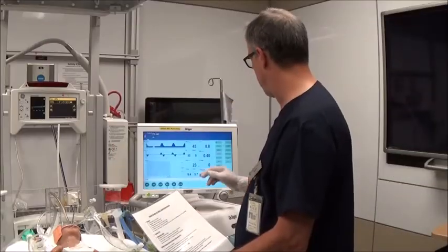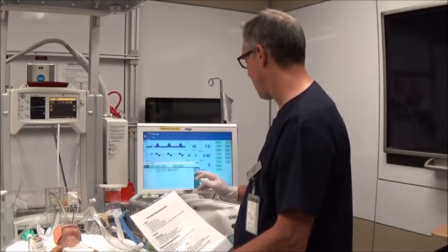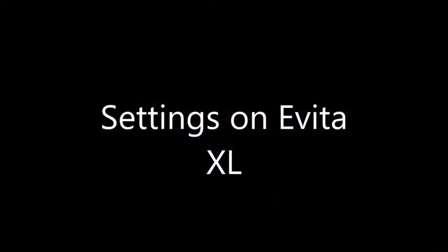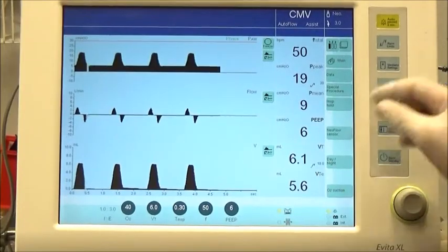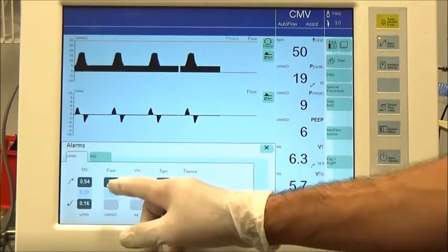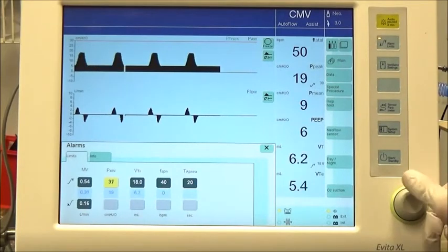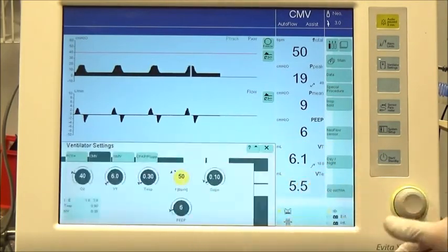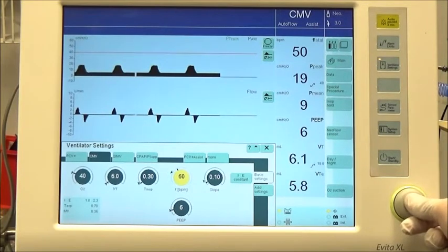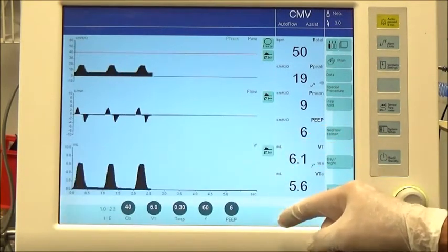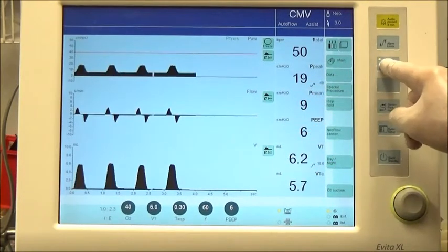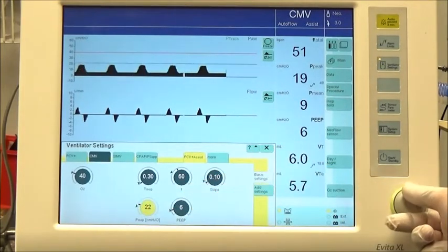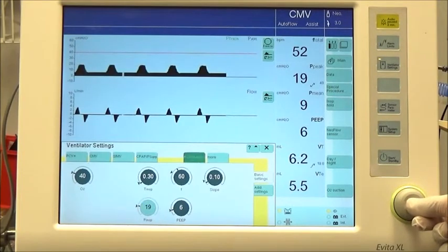Adjust the ventilator settings as per the Quick Guide instructions; these will vary depending on the ventilator in use. Prior to administering surfactant, increase the high pressure alarm to 40 cm of water pressure and increase the ventilator frequency to 60 breaths per minute. Note the current PIP on volume target mode, then switch to pressure control ventilation using this PIP, targeting a volume of 4 to 5 mls per kg.